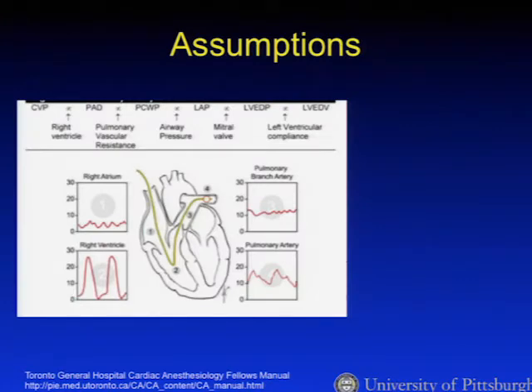And you are likely not surprised by this lack of correlation, because you're aware that many assumptions exist between measuring CVP, or right atrial pressure, and the concept of left ventricular preload all the way over here. And assumptions are not the friend of anesthesiologists. But what if we could float a catheter even further through the right ventricle into the pulmonary artery and inflate a balloon such that the catheter tip is in a column of blood that's continuous with the left atrium? Maybe that would be a better marker of volume status.